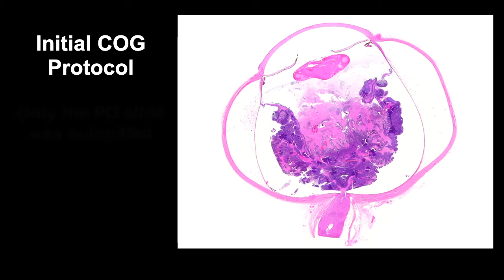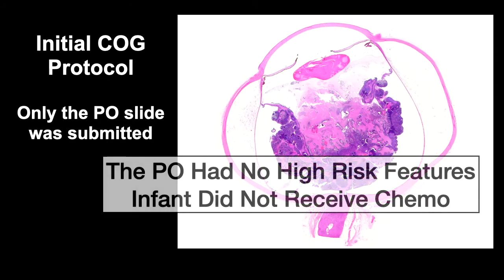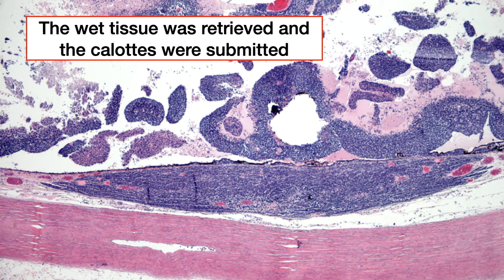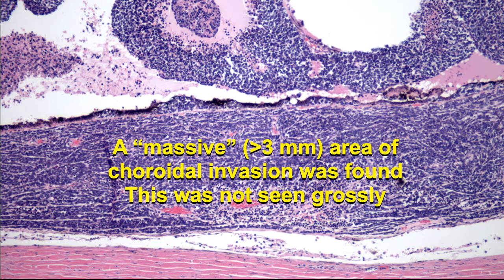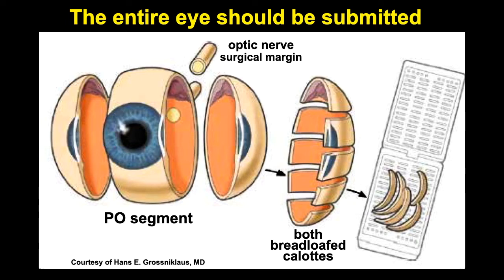A case from Wills actually changed the COG protocol and the standard protocol for dissection of eyes with retinoblastoma. In the initial COG protocol, only the PO slide was submitted, and this slide from our case showed no high-risk features. Hence, the patient did not receive chemotherapy. Unfortunately, the patient developed distant metastases several months later. We retrieved the wet tissue, submitted the calottes, and found a massive area greater than three millimeters of choroidal invasion that had not been seen on gross macroscopic examination. So the COG study protocol was changed to require submission of both bread loaf calottes in addition to the PO segment and a transverse section of optic nerve. The entire eye should be submitted, and you need skilled histotechnologists who know how to cut eyes and prepare high-quality sections.